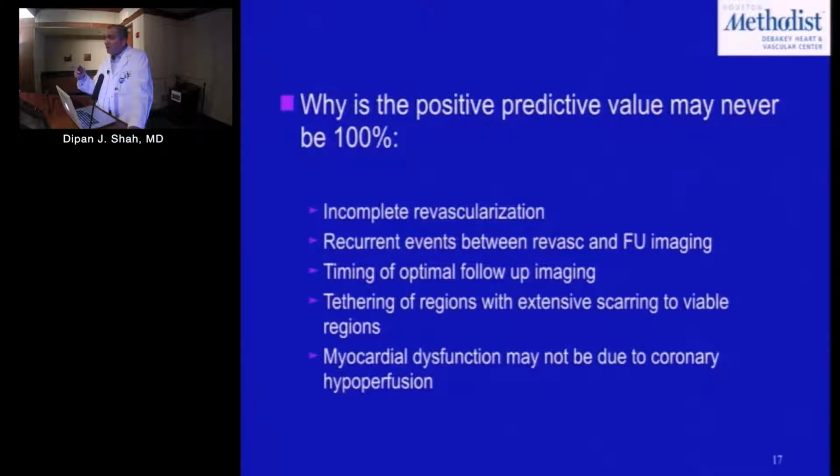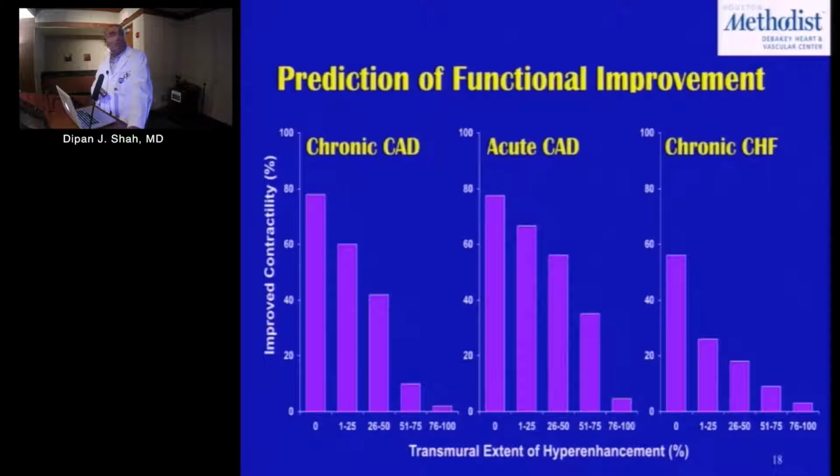And then I think Bill and Dr. Q have done some work looking at dobutamine echo late after revascularization, showing that some of these segments, even though they don't improve contractile function at rest, they may still improve contractile function with administration of dobutamine after you revascularize them. So again, there's a lot of issues that come into play. And so I think you'll never see a technique which is going to give you 100% positive predictive value. I think that's an expectation that we should not hold.